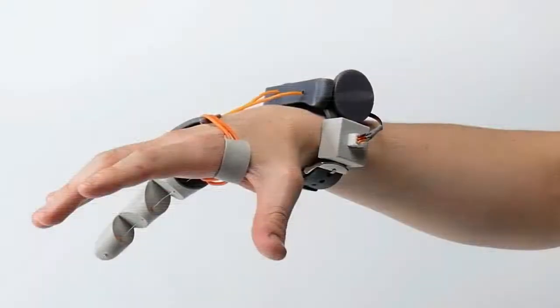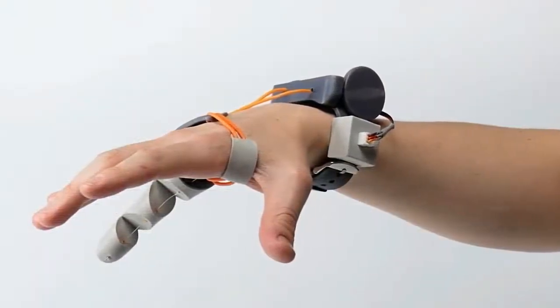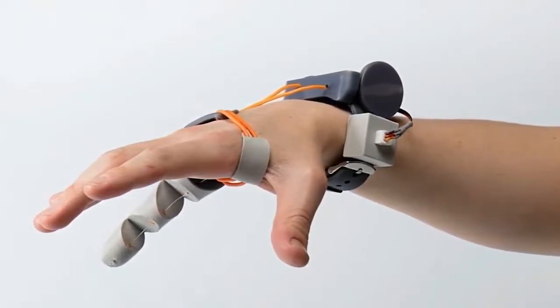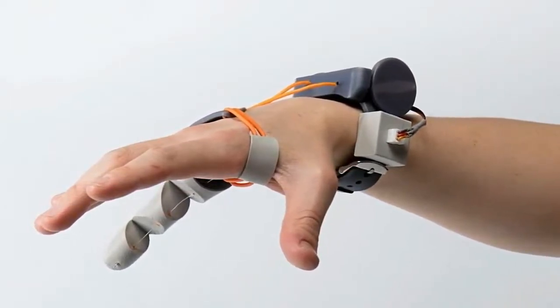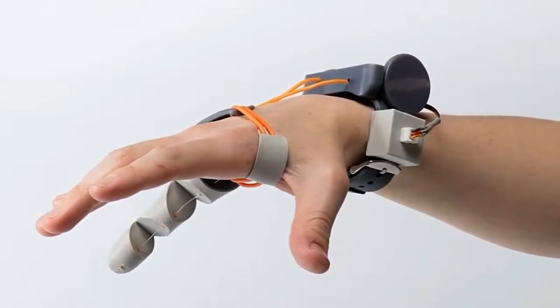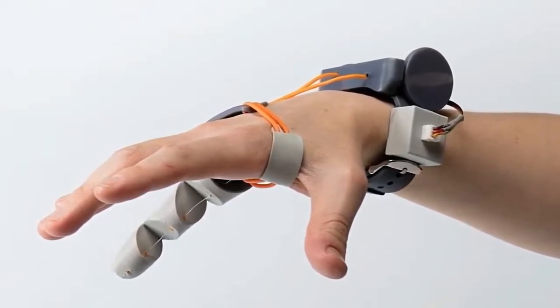The thumb is motorized and connected by cables to a bracelet. Pressure sensors underneath the wearer's feet connect to the thumb's motors via Bluetooth. Working the extra digit just requires you to press down with your foot.